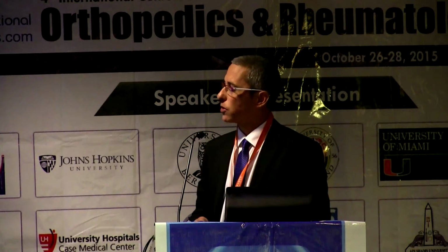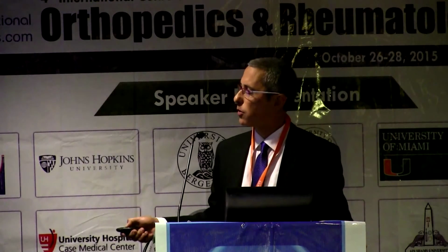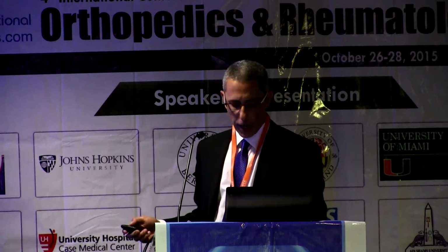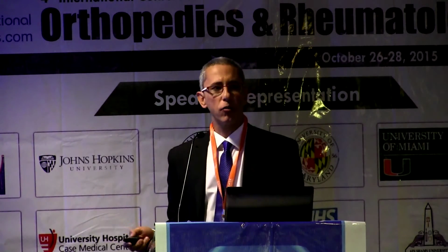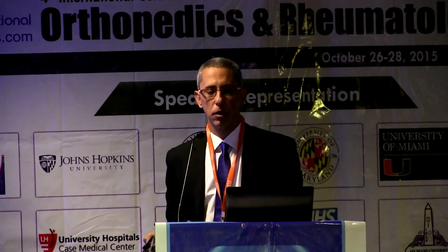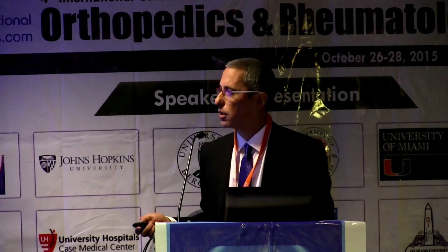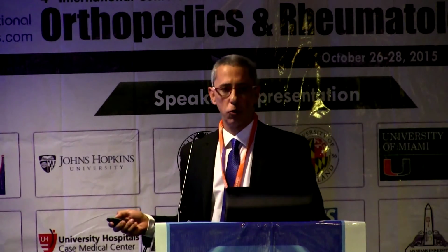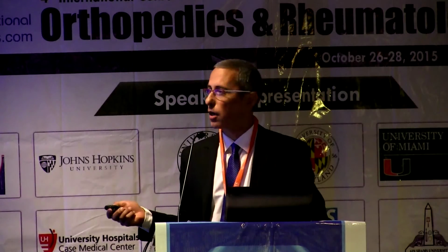This is our ultrasound at 1 year. You can see if there's some tissue over here between the humeral head and the acromion. So my 5 to 6 year experience, we have plenty of questions. How does it work? We don't really know how it works because after 3-4 months it's resolving. So is it an artificial bursa? In some cases, like in this lady, when we saw the ultrasound, there is kind of a bursa. However, in other cases, there is none.